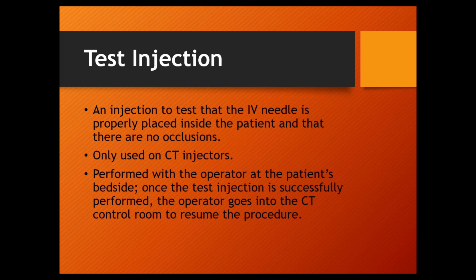So when I hit this little arrow here and it brings up my first phase line, the options over here are test inject, contrast, flush, a mixture of the two, pause, hold, and so forth. So this test inject function is available on the first phase. And you'll notice here, it's blue, a flow rate of 1, a volume of 20. It's not normally 20, I put that in there. And then this little line here, and again, this is universally true.